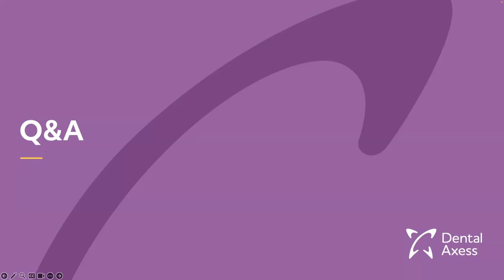But if you request, I don't want ideal, I want to just improve this and that, that is also possible. That can be done, but you need to understand we will change the final position, and probably not achieve all that needs to be done on that treatment plan, by reducing the number of aligners.